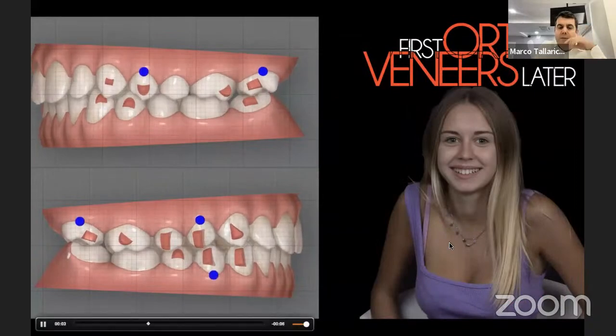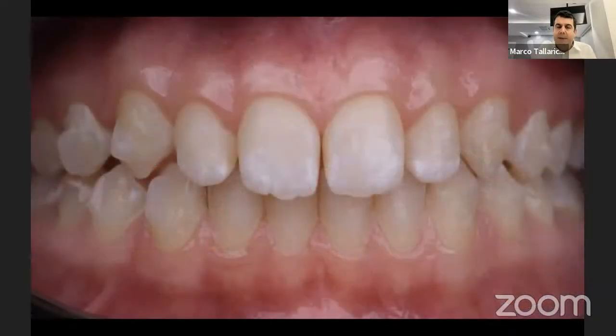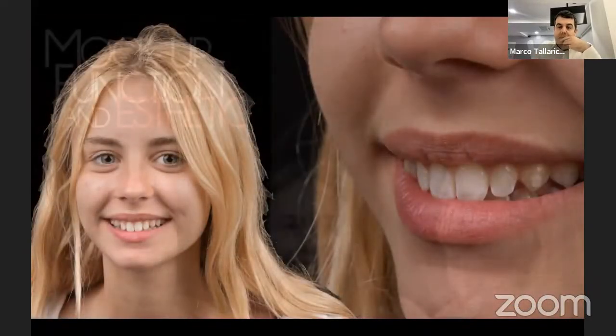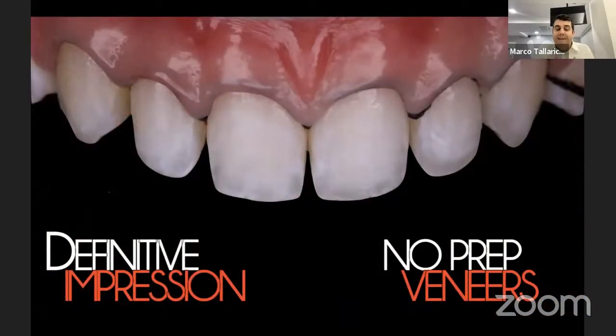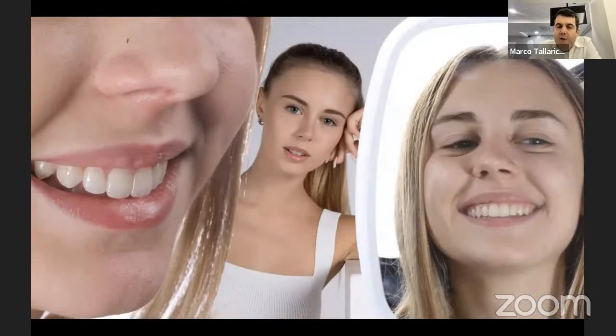Just very quickly, the orthodontic treatment with some aligners. After orthodontic treatment, we put the midline in the middle and we close the space. So we can move to a mock-up. The mock-up is just an additive mock-up, showing her the change of form, but most important is no-prep veneers, only on the enamel, without any kind of preparation. She's very young. I want to bond my veneer on the enamel and also to give a natural aspect. And this is the final appearance of the patient with some emotional pictures.